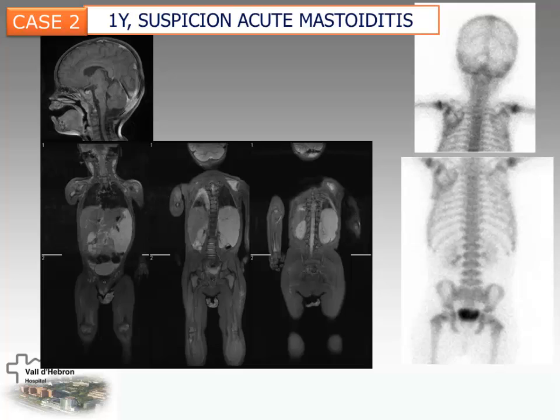What about the bone scan? Is there any abnormality? Yes, but on the planar images, can you see the left scapula? Yes, very well. It seems to be insufflated, isn't it? This was not detected by MRI. They missed the scapula.